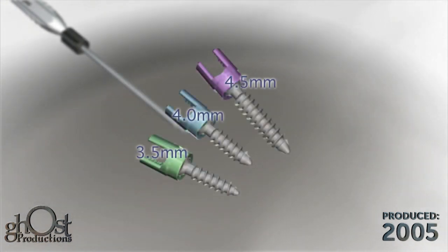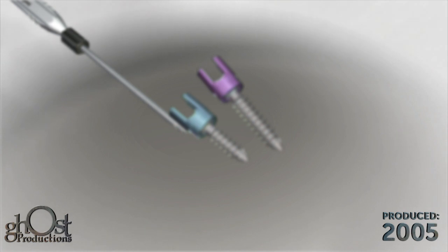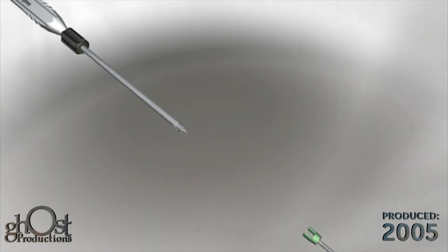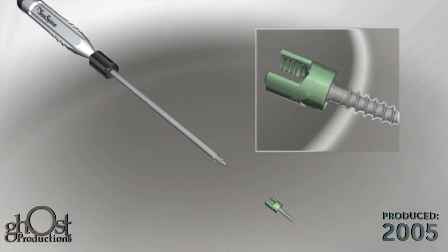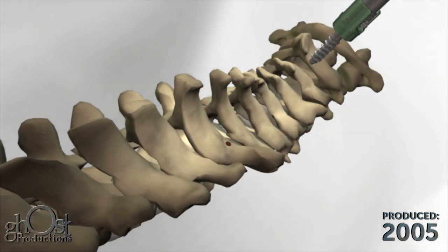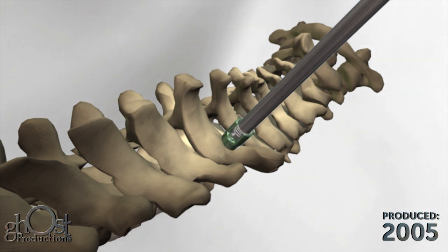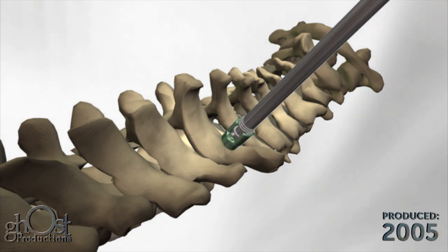After determining the appropriate screw length, load the hex cavity of the screw onto the hex tip of the polyaxial screwdriver. Secure the screw to the screwdriver by turning the knob on the screwdriver sleeve clockwise until the screwdriver is fully engaged with the seat of the screw. Screw length may be confirmed using the gauge on the corresponding screw caddy. To disengage the screw, hold the handle and turn the knob on the screwdriver sleeve counterclockwise.